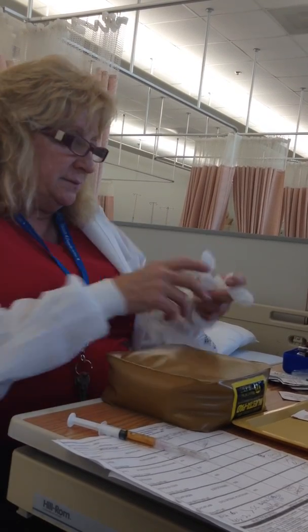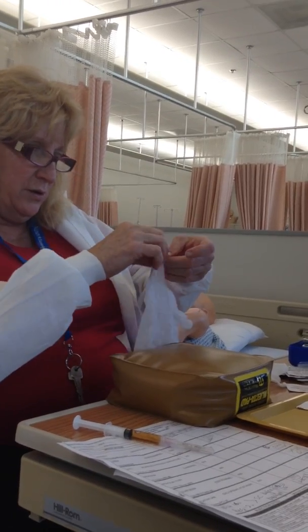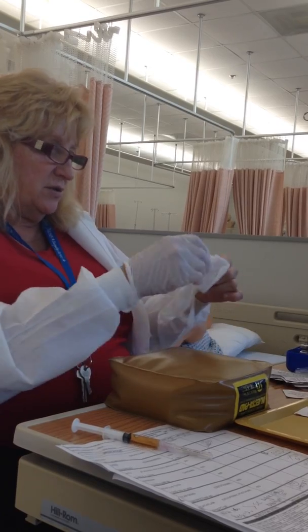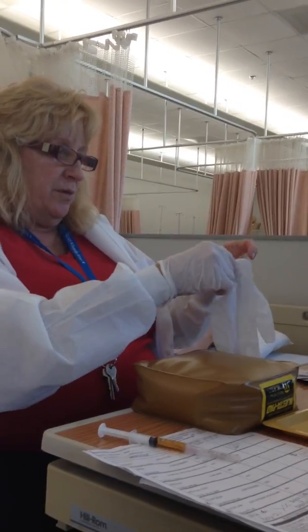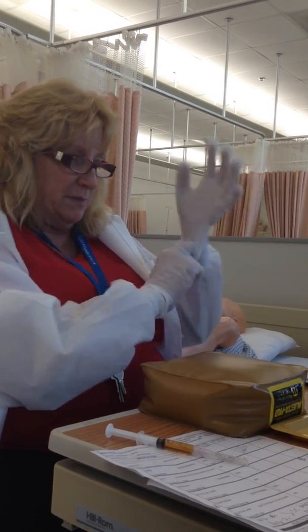I'm going to put my gloves on. Now we're in the room. Hi, I'm Kathy. I'm going to be your student nurse today. And I'm going to be giving you 2 medications. And I've checked the doctor's order. And I'm going to provide for safety and privacy. And I'm going to perform a skill in a safe and effective manner, and then I'm going to document and wash my hands when I'm done.